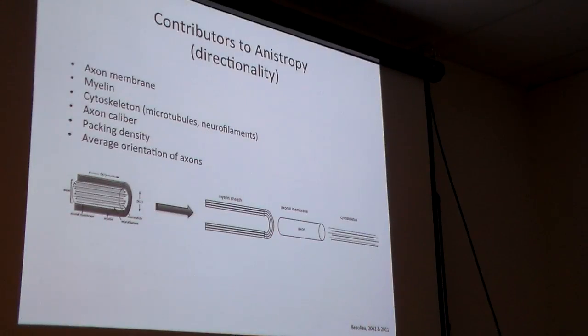And I just mention that because when you read about DTI studies, often they will describe that, oh, the two groups had a difference in integrity because one of these measures is different. And it's a hard thing, yeah, we always argue over the term integrity. I know what you're talking about. But it's partly because it's hard to explain, well, gee, we found a difference in the measures, but what exactly does it mean? It can be a little challenging to interpret exactly what it means biologically, but as you get to know the different measurements, by combining different measurements, you can get some specifics of it.